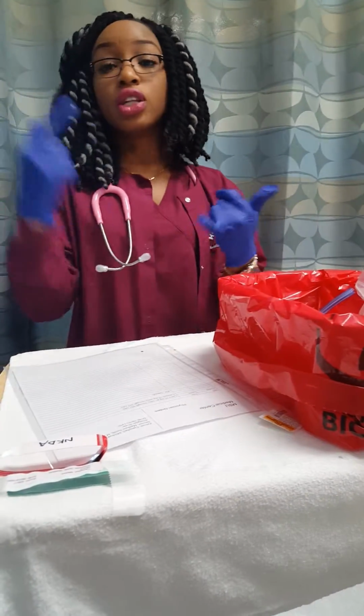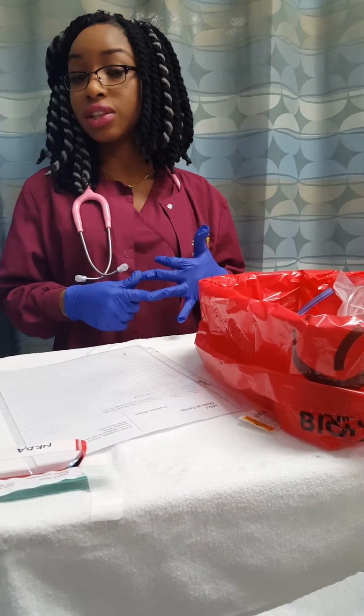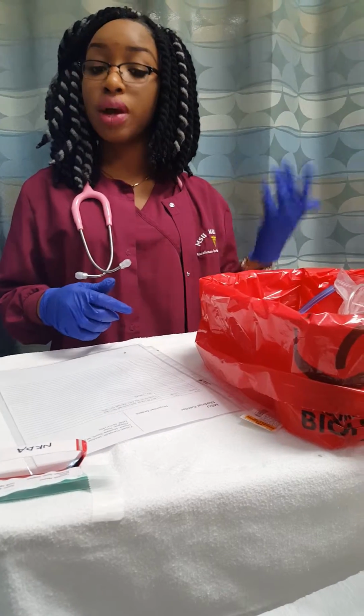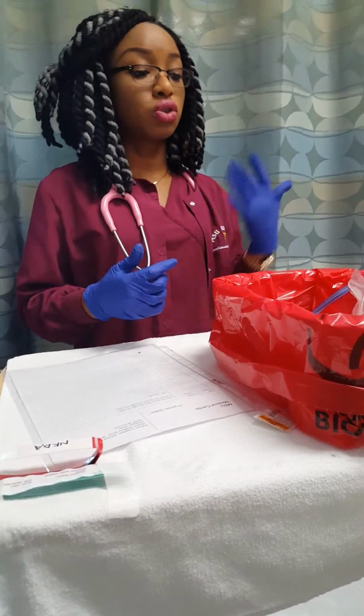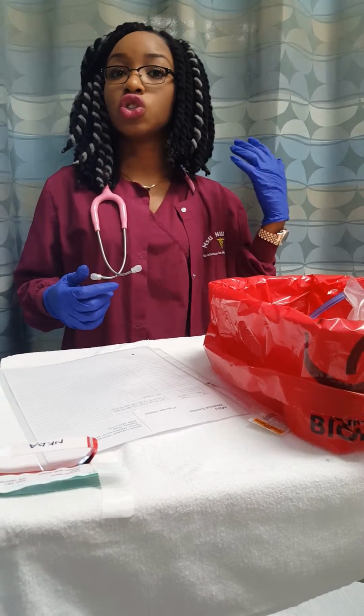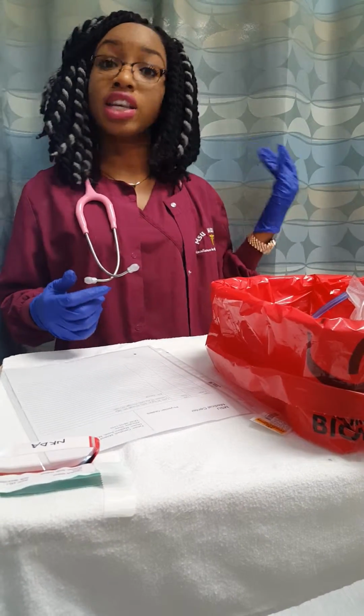the amount of medication using the patient's rights again, making sure I give the right medication, the right dose, at the right time, through the right route, through the nasogastric, making sure it's the right patient. And I'm also going to document the patient's tolerance when I was inserting the medication, and also the side effects, which I explained to the patient.